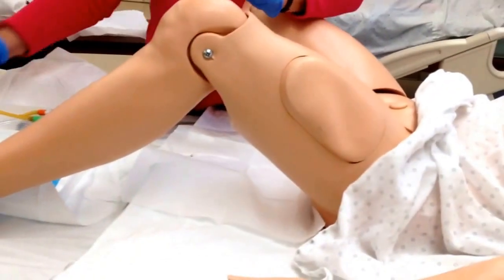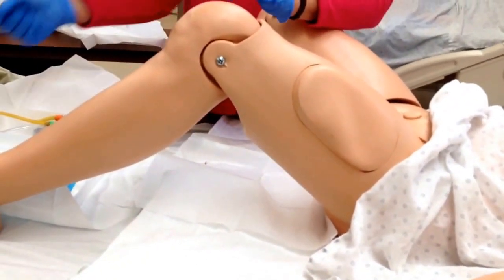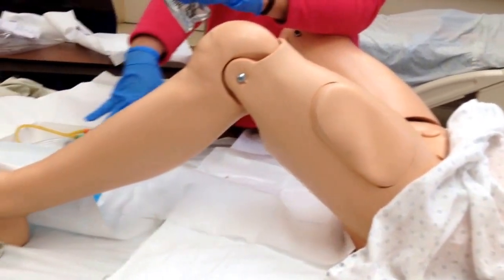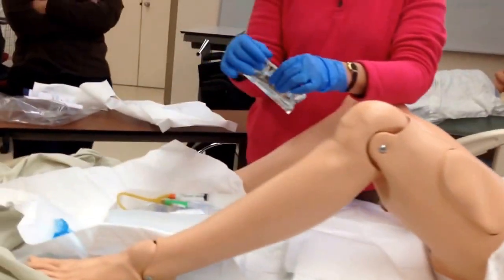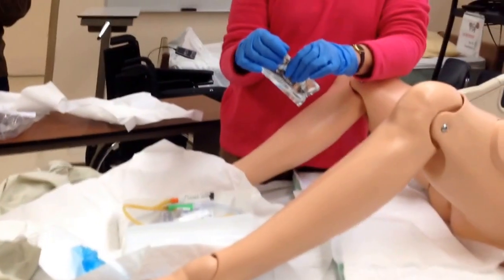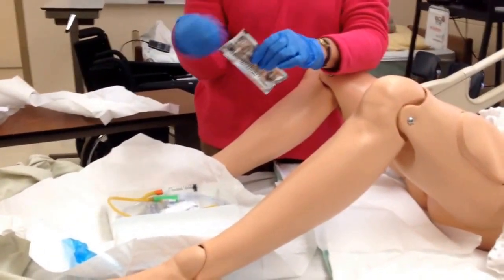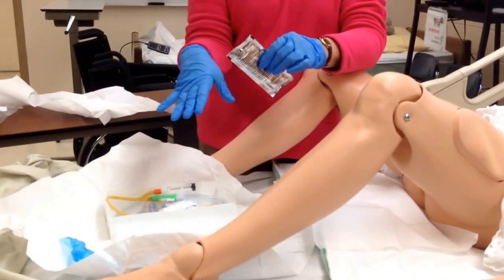Now, what I'm going to do is take my swab sticks. Now, there are 3 of them here. You have to open these up and lay them out onto your sterile field, because if you don't open these up now, you're never going to open them, because you're only going to be working with one hand, okay? So you'll take them out and put them on your sterile field, okay?